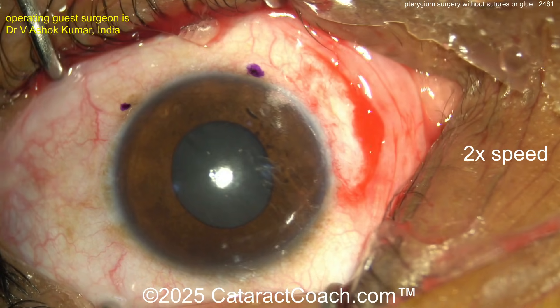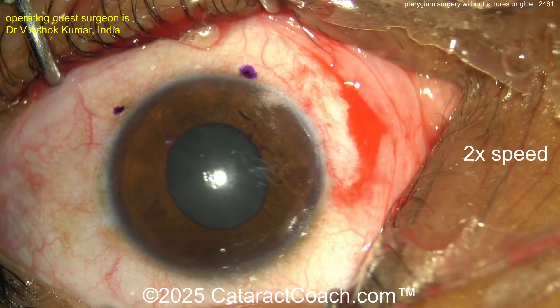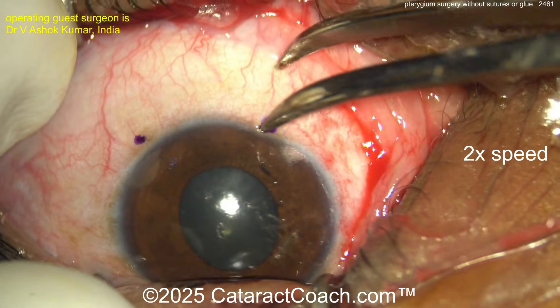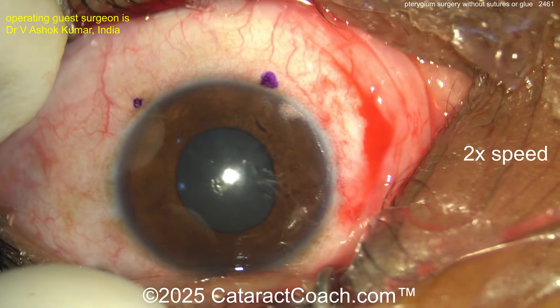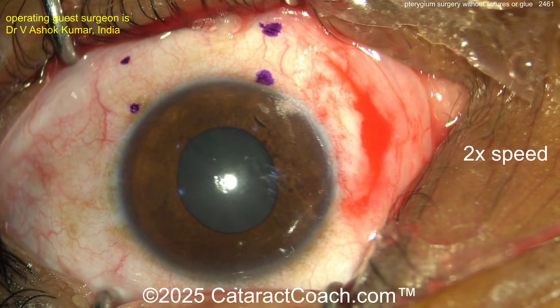Now measuring out where you're going to take the graft from. I would have done a little more dissection there under the nasal conjunctiva, because there's probably more pterygium there. But measuring out the graft site and marking that off — I like that.